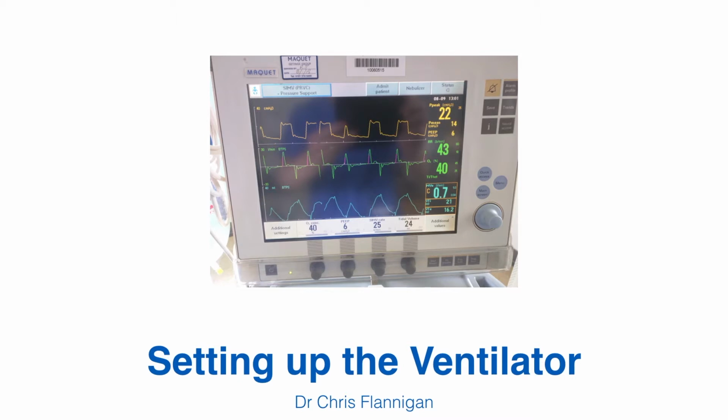So for somebody who's not ventilated a patient before, the ventilator can look like quite a scary machine. Lots of lights, lots of buttons, and you're not really too sure what to do with it. So I want to break things down a bit and look at what a ventilator actually does. And all it really is, is a box that blows air into your patient. And when you look at it in that way, it's actually quite a simple machine.